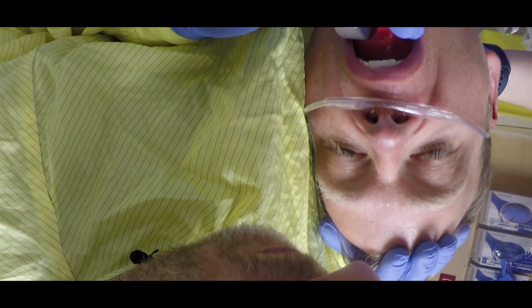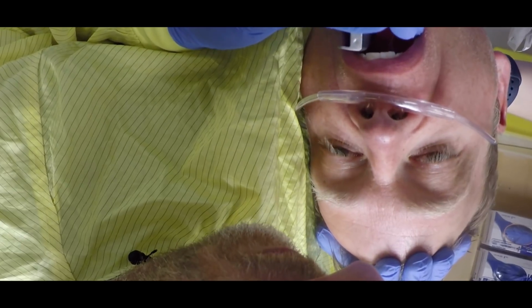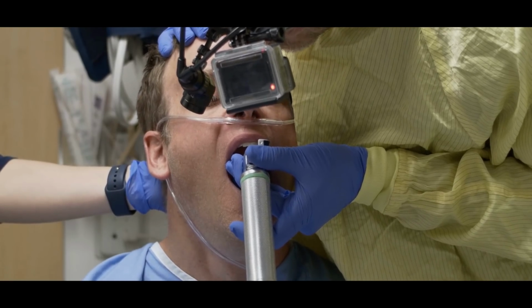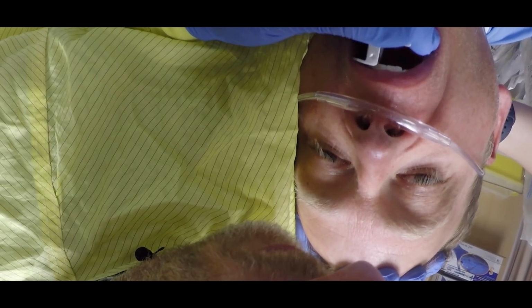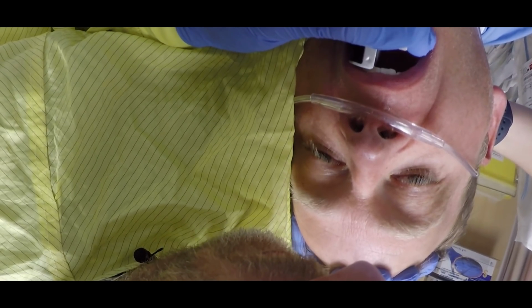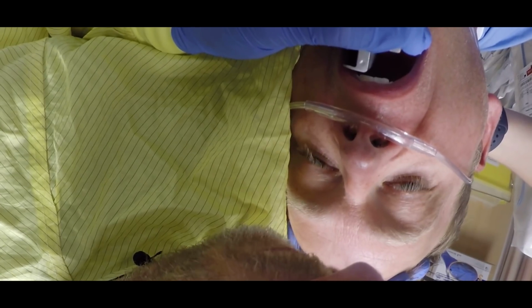So we're just going around the back of the tongue. You can see we got really good anesthesia here. And there's the epiglottis. And if you can take a big breath in, Chad, so we have a grade 2 view. And let's just go down a little more and see if we can get right into the vallecula. And Chad is clearly tolerating this very well. There's the epiglottis. Take a big breath in.